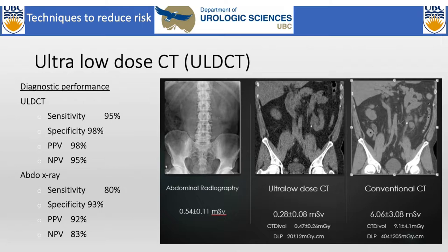Difficulties: you have to have access to a CT scanner, and you also need a radiologist who's going to read through these. These were also patients coming in for SWL, so you knew that they had stones, or the chance of them having stones was quite high. So I'm not sure if you guys have done anything in just first-time stone.